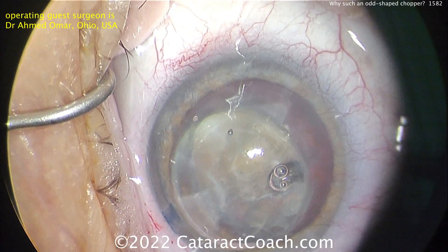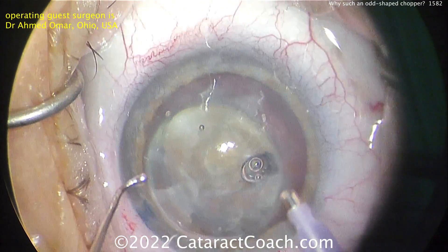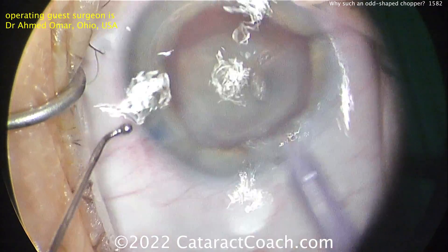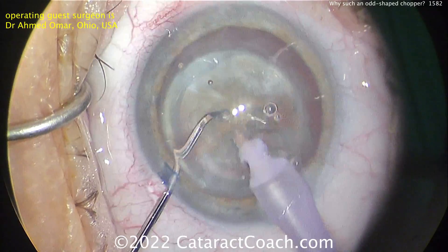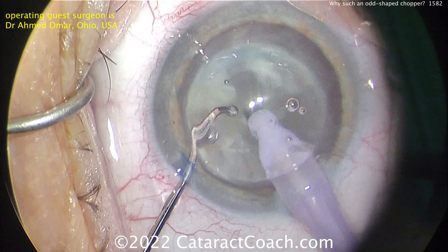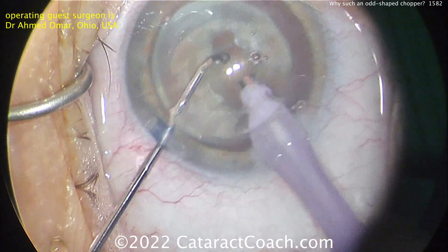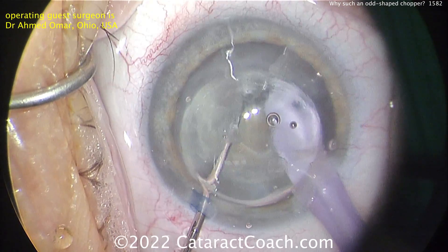More dispersive viscoelastic can protect that cornea. The last thing you want to do is do a cataract surgery that's going to push the patient over the edge. Watch — as the phacoprobe goes in, it looks normal, but as the chopper goes in, you'll see it looks distorted because the cornea is distorted. So there's the phacoprobe going inside the eye. Here's the chopper. It looks so strange. This funhouse mirror distortion is just because of that cornea — that graft-host interface zone.